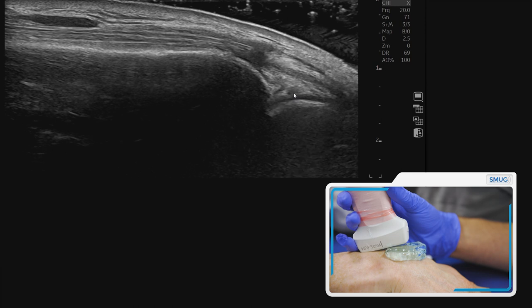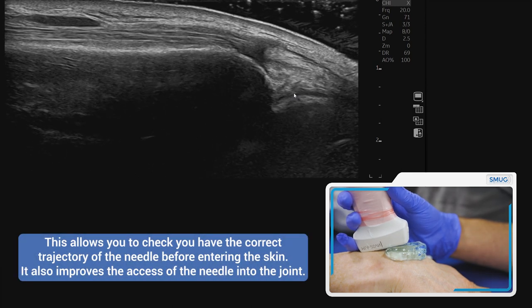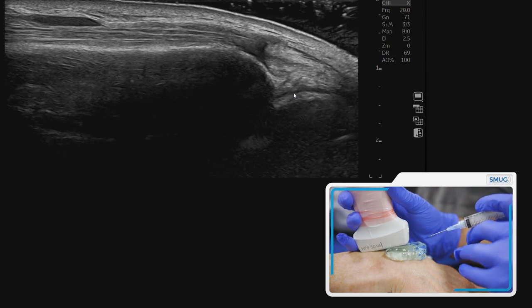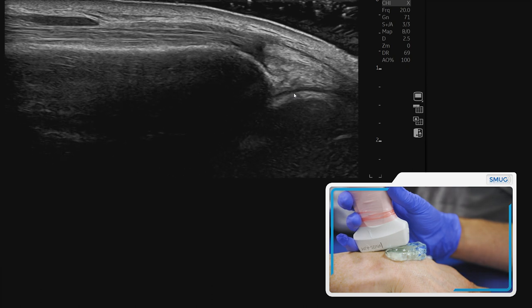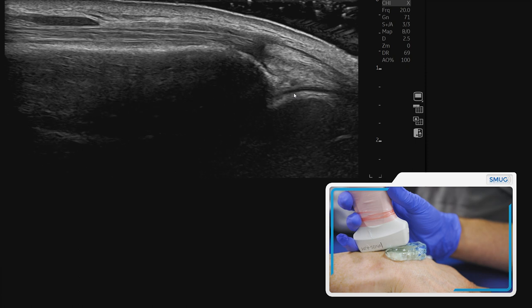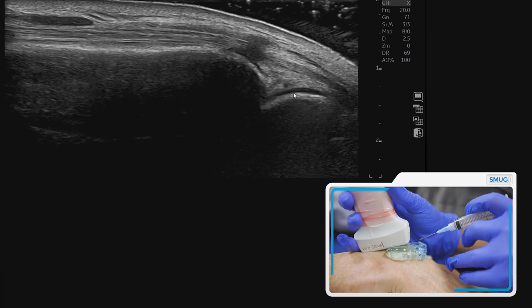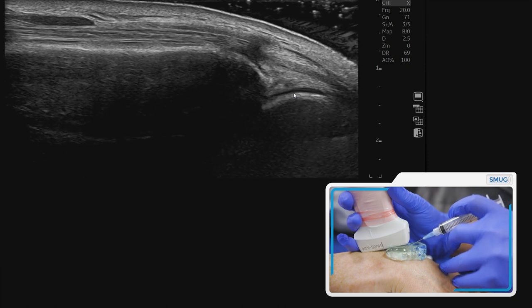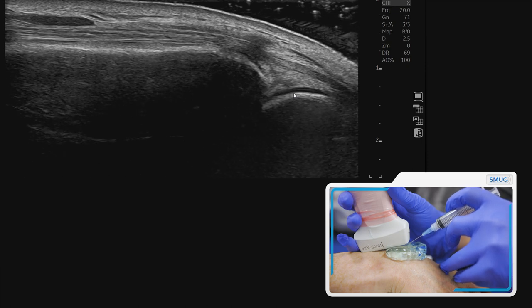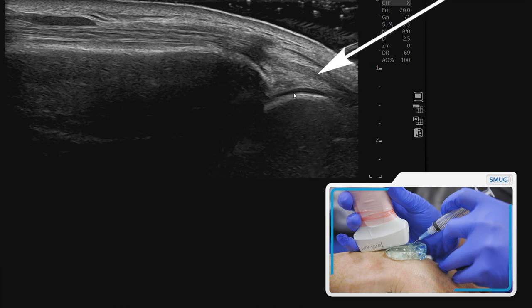That has a few advantages, but one of the main advantages is you know what trajectory you're going into when you're about to pass through the skin. You can see where the cursor is, and that allows you to make sure that as you go in at a certain angle, you know you're going to get to your target tissue. It also means the joint is more open, so you can get the injection in a little bit easier, and it often makes the whole procedure less painful for the patient. As you go through, you can ensure you're at the right angle, see the needle, and just pierce the skin.